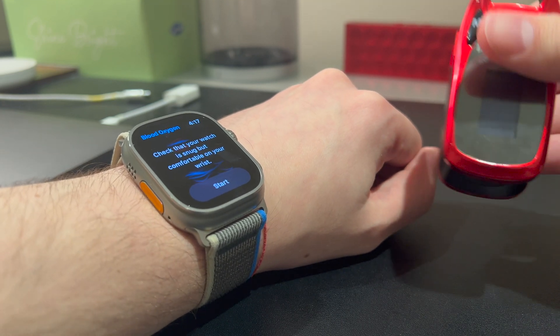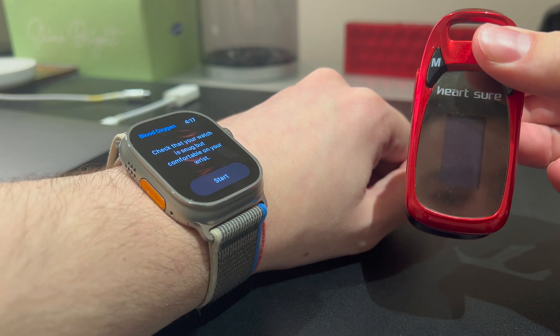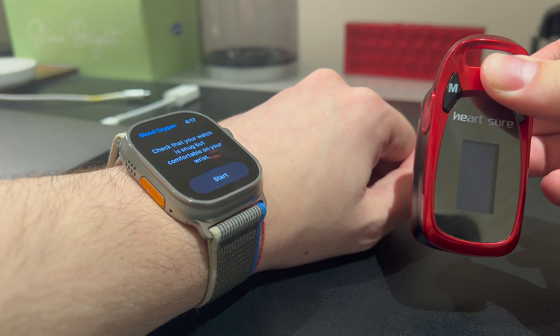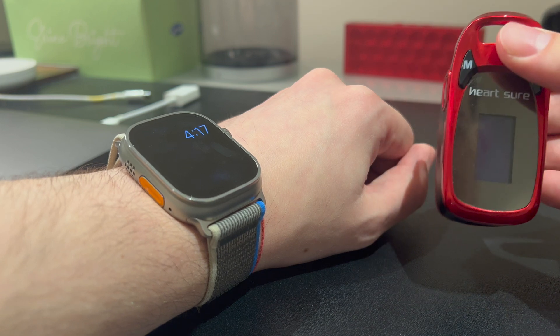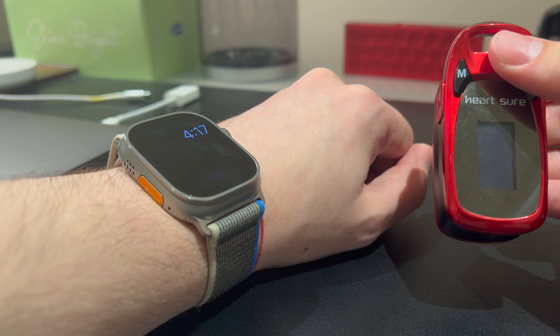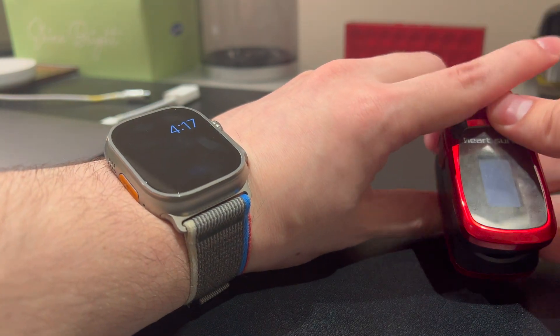We've got right here a medical-grade one that I've picked up from a pharmacy — something we had around during COVID days. I've seen a few of these videos online, and I think it might be beneficial to test it out with the Ultra. Not a scientific test by any stretch of the imagination, but we'll do a few tests just so you guys can see, and maybe it'll help you.